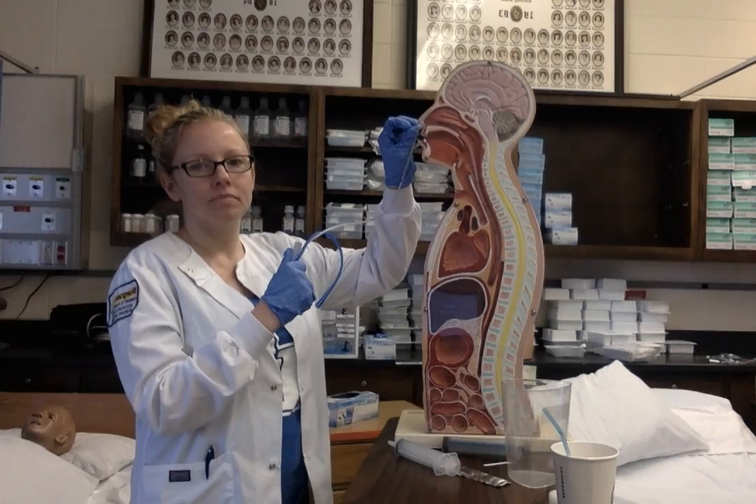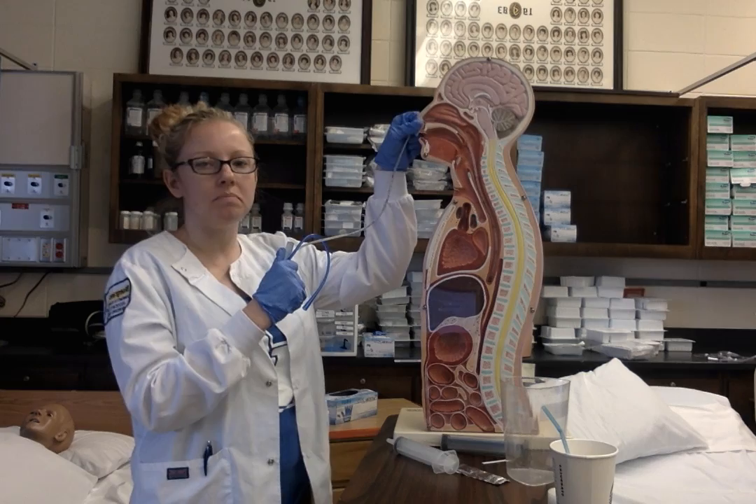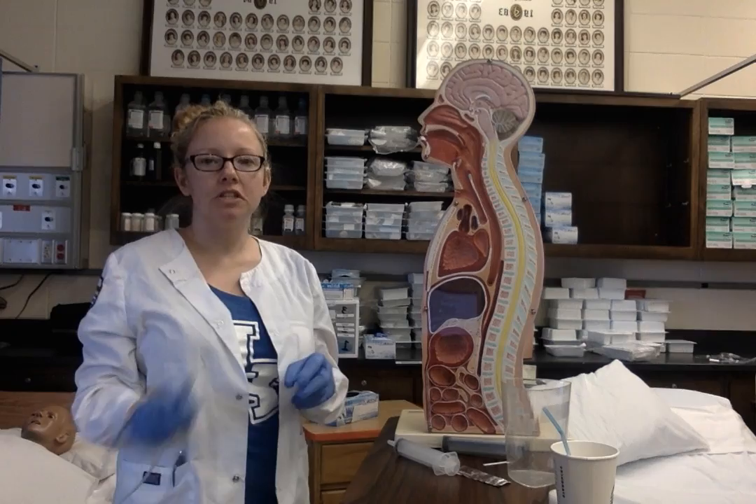I'm going to instruct the patient to take a deep breath and hold, then I'll unclamp the tubing and quickly and smoothly pull the tube out. I'm going to dispose of the tube and the drainage equipment and clean the nares for mouth care.